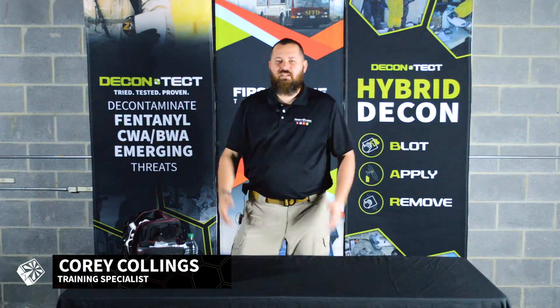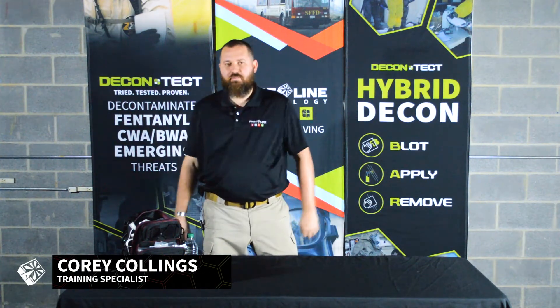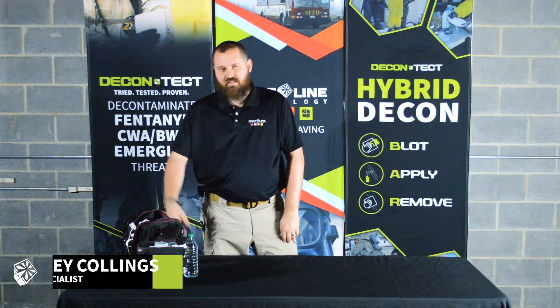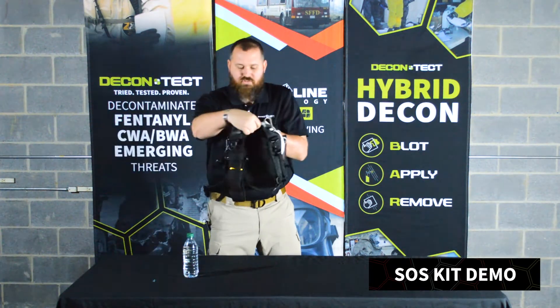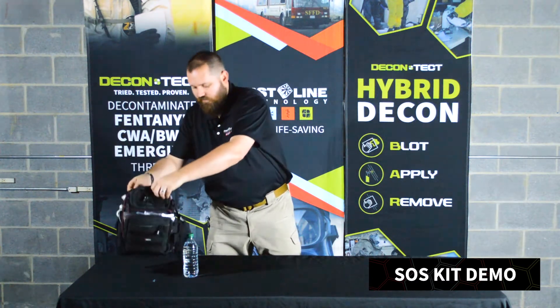Hey, it's Cory with Firstline. Today I'm going to walk you through our Synthetic Opioid Safety Kit, commonly known as the SOSK. First things first, it comes in this nice little shoulder pack. Everything's contained in one little area.